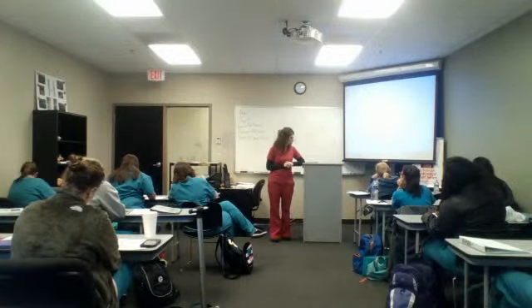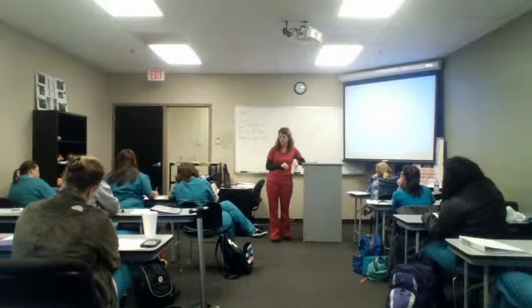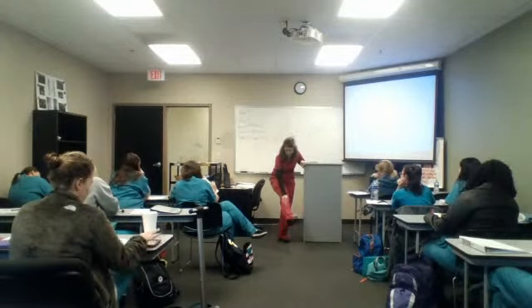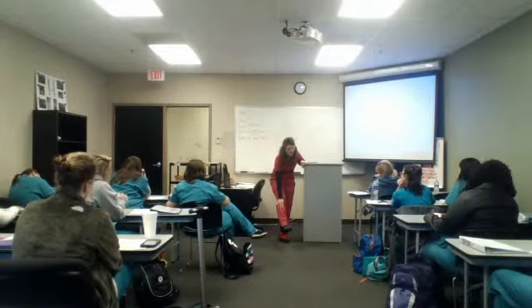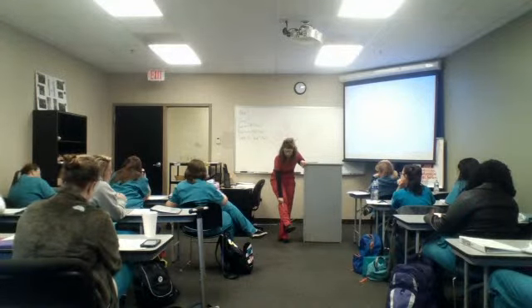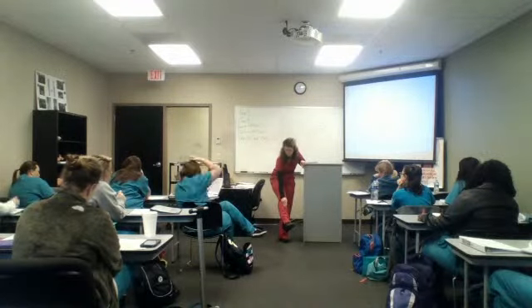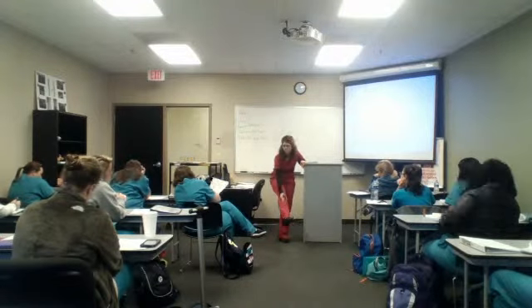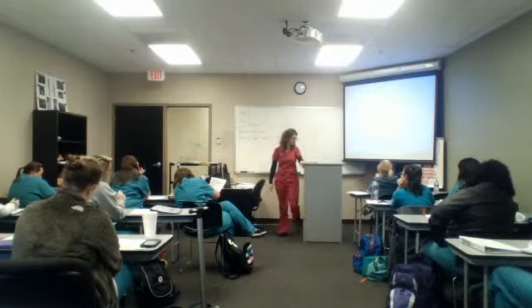The anterior tibial vein drains exactly what it says, the anterior part of your leg. To find it, you will scan on the lateral anterior, right beside the bigger bone, the tibia. Put your probe right beside it and angle out towards it laterally, and you're going to bring in the anterior tibial. So it's anterior, but lateral on your leg.